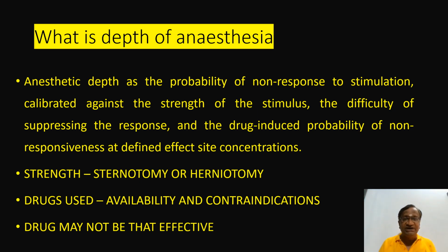I will tell you now, you can have a strength of the stimulus. It is sternotomy or herniotomy. So we can have non-response to stimulation for a herniotomy and for sternotomy at a similar depth, no? So depth varies there. Availability and contraindications of drugs.